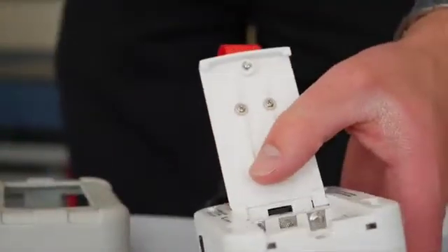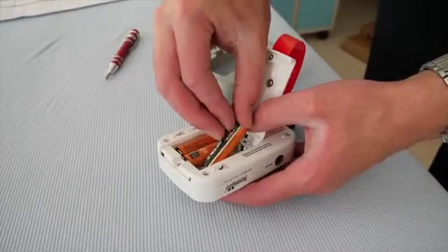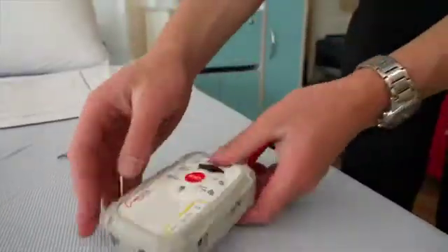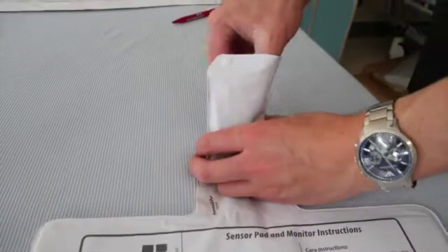Take the monitor, remove the soft cover, open the battery compartment, and insert the three AA batteries. The monitor will beep once to confirm it is turned on.